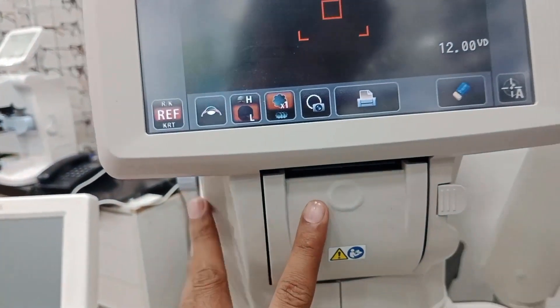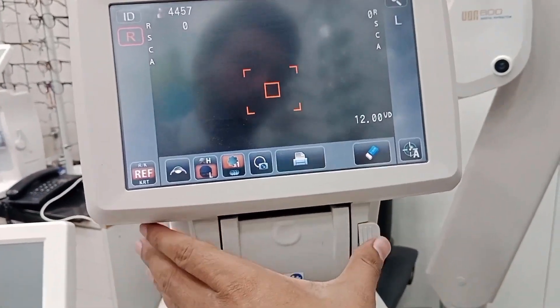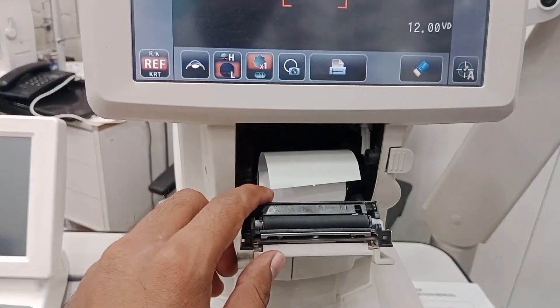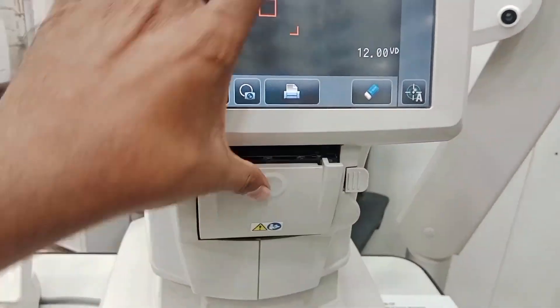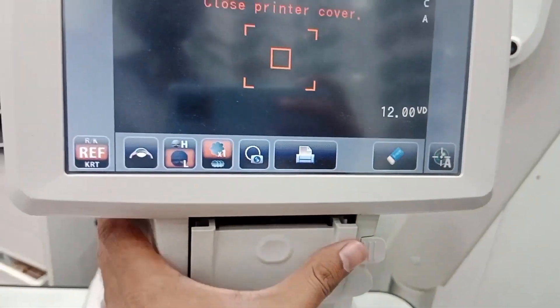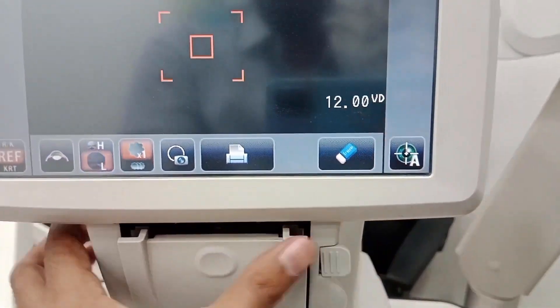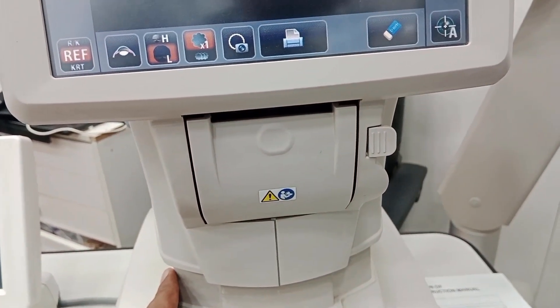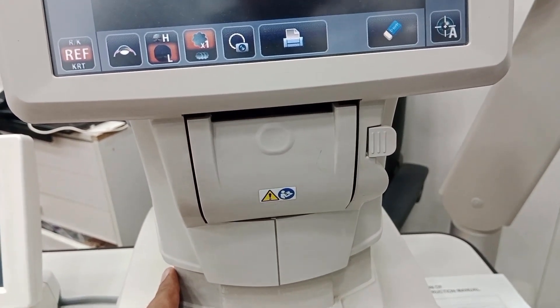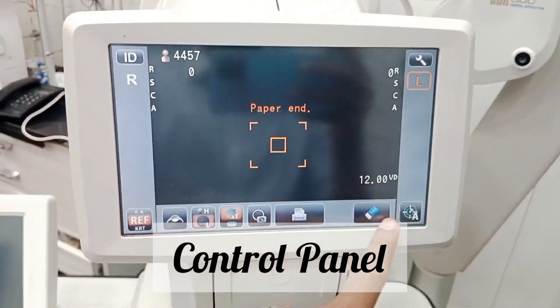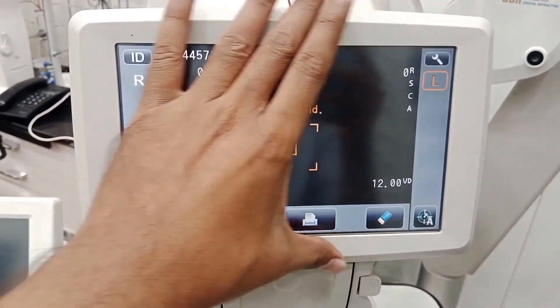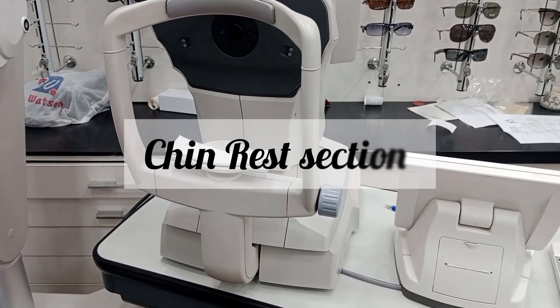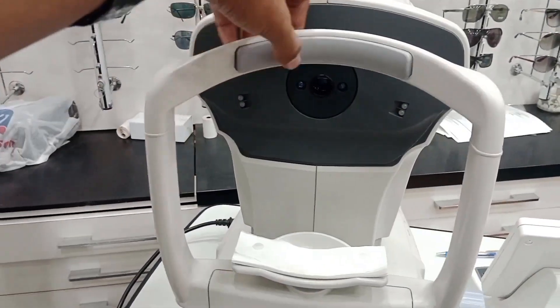There are printer papers inside. Pressing this button opens the printer cover so you can see the papers. Close it properly to secure it. This screen is called the control panel, and we will learn about the different settings on it.